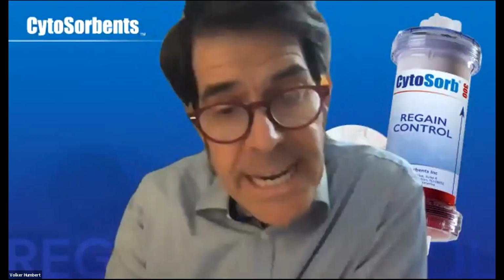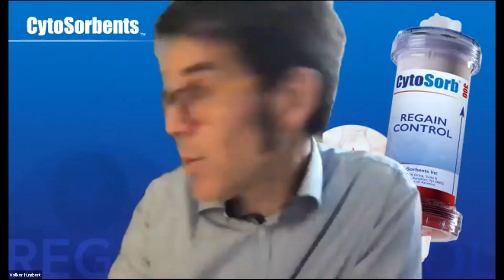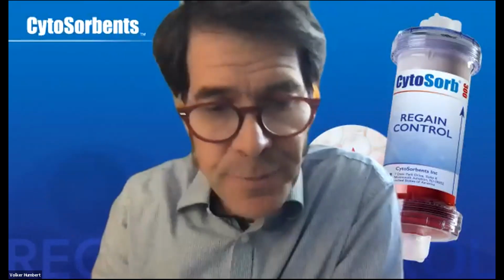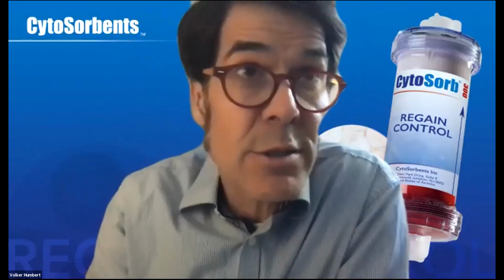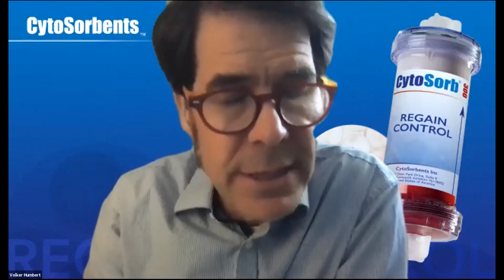In principle, yes, but of course it's very important to make clear that Cytosorb is no antiviral therapy. Cytosorb is not killing the virus or deleting the virus from the bloodstream. As we know, more than 1,000 patients have been treated with COVID-19 and Cytosorb therapy.